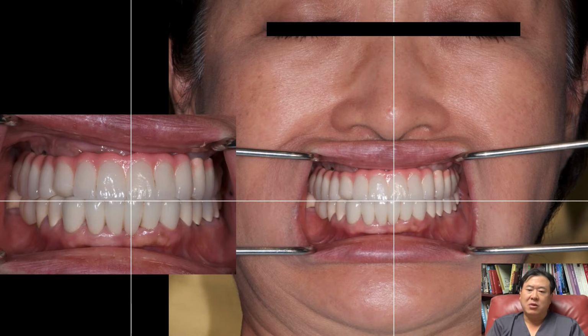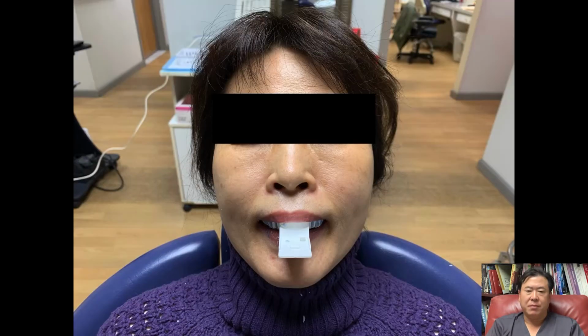Am I falling into a trap here? Should I be hesitant? Should I convince the patient to lower her expectations? With a great armamentarium such as R2GATE, R2 Studio, and micro CT scan, and great support and backup from my laboratory, I promised her that I could meet her expectations this time.